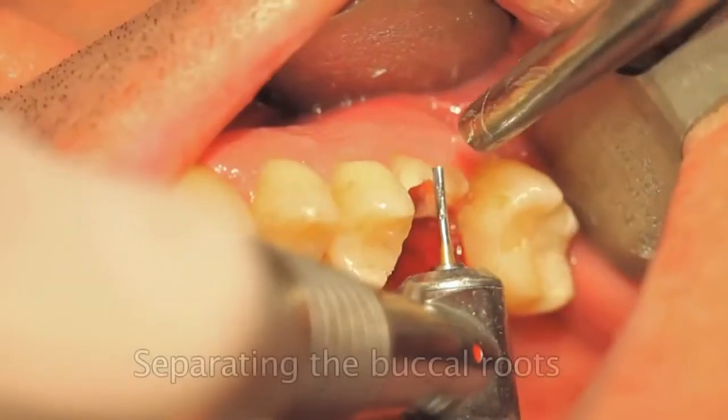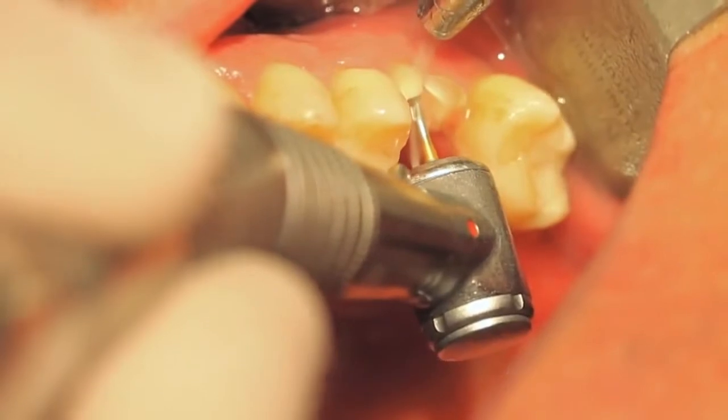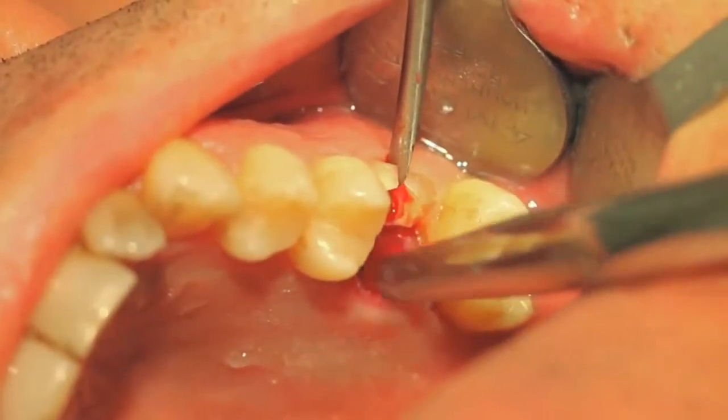It is essential to remove the palatinal root first in order to be able to luxate the buccal roots in the distopalatinal and mesopalatinal direction.